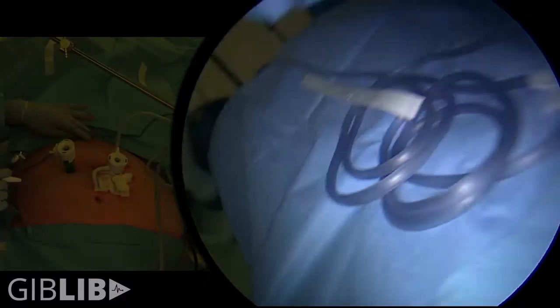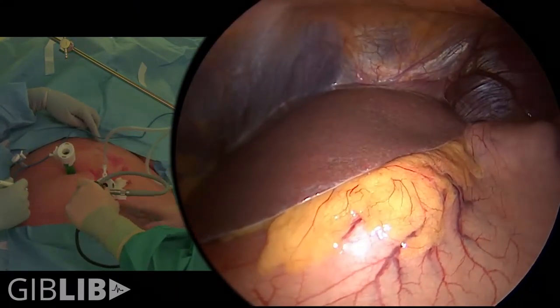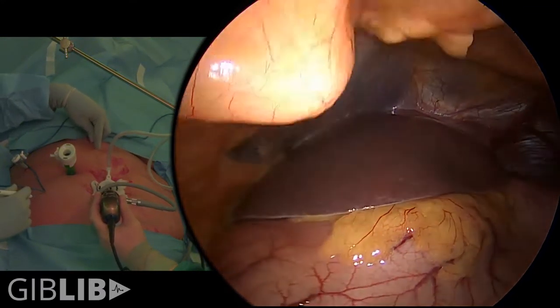For this operation the surgeon stands on the patient's right side. We use a 5 millimeter trocar and a 15 millimeter trocar. Then we put a liver retractor in the sub-xiphoid position by first putting a 5 millimeter trocar in and getting the space.